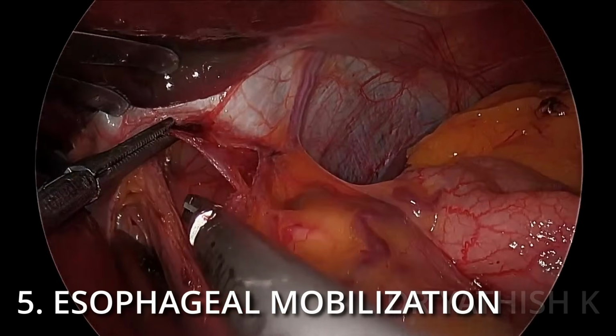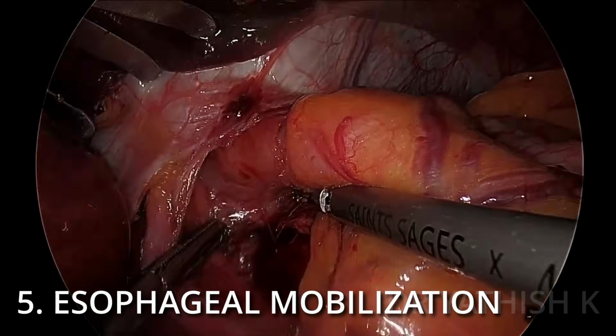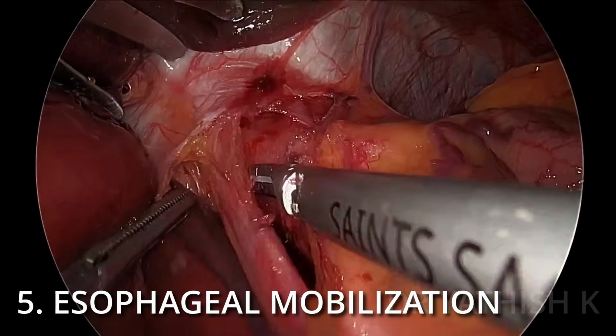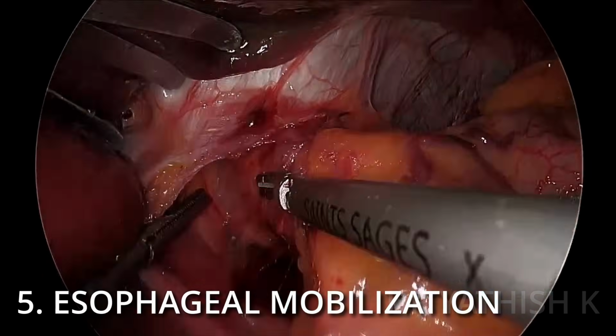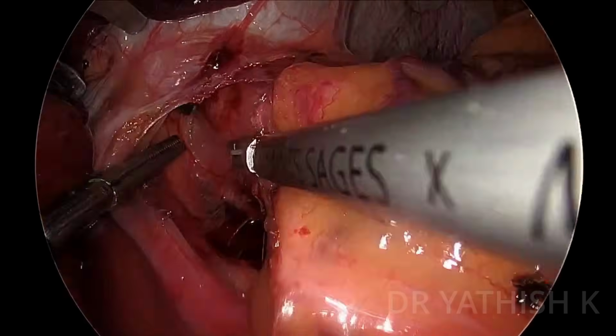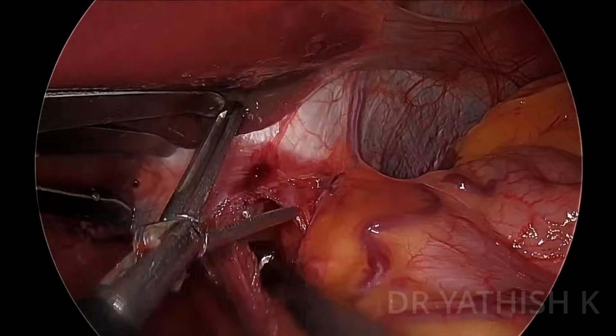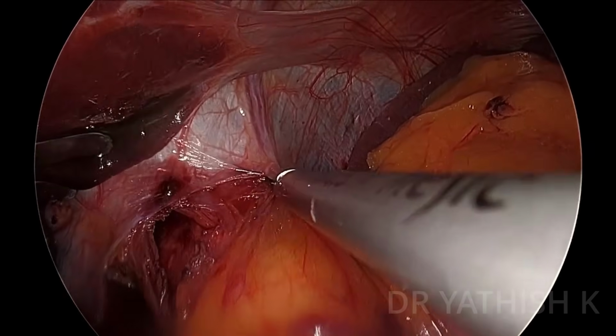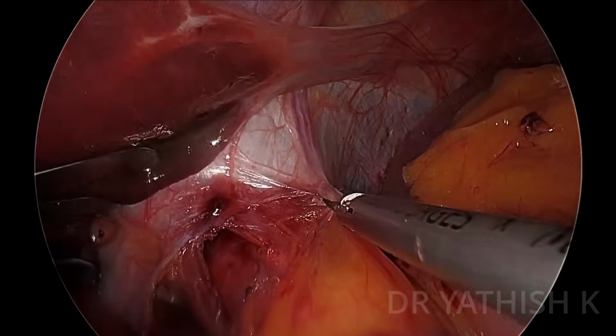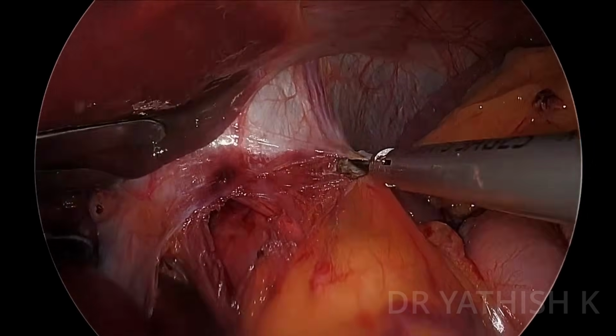Once you have done a retroesophageal window, our next step is esophageal mobilization. You have to mobilize adequately 5 to 7 centimeters of the esophagus. The reason for mobilization is to obtain a good visualization and for a proper controlled myotomy.